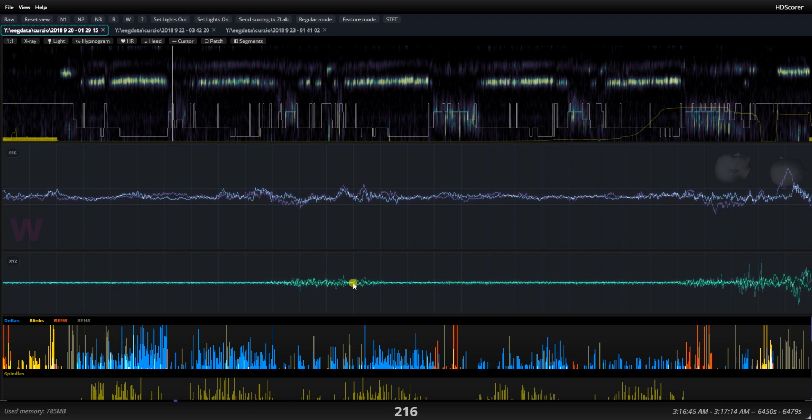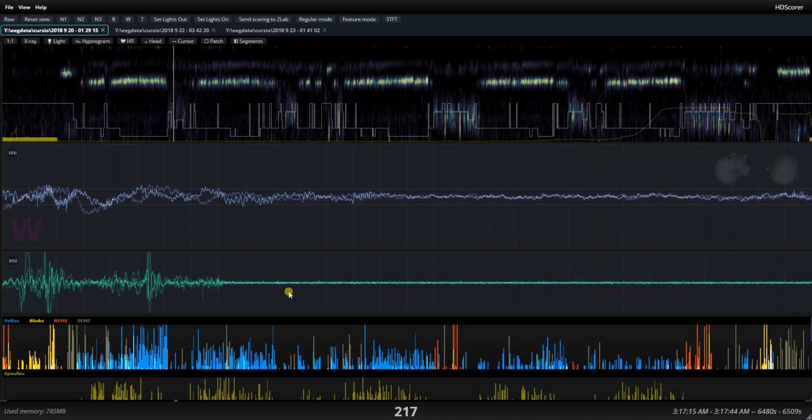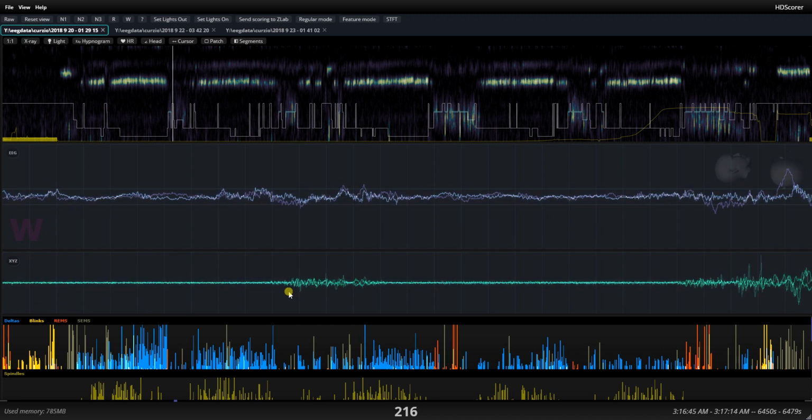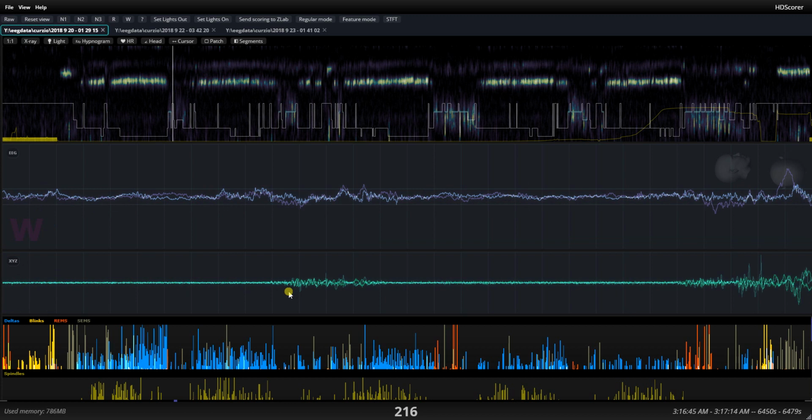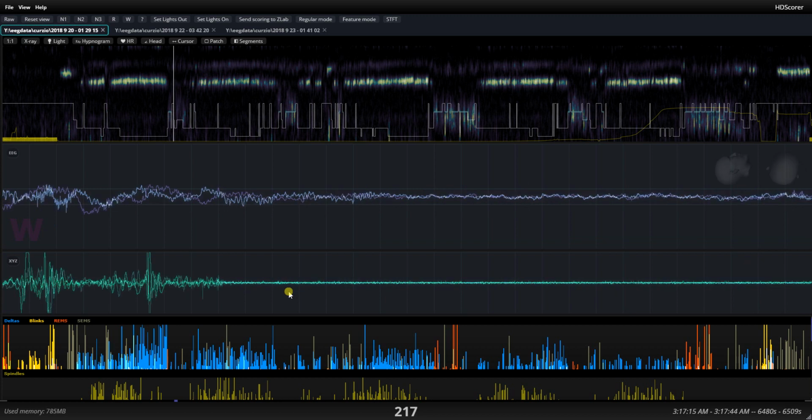And what I've done is to simply remove all of the movements that are less than 5 seconds and then threshold the rest. And what this leads to is having things like this scored as wake, which might not in principle have been scored as wake on AASM. However, I think it's very handy because here the patient is moving around.